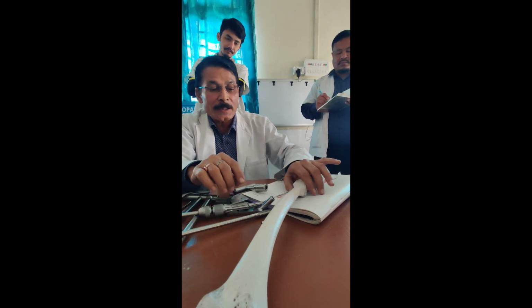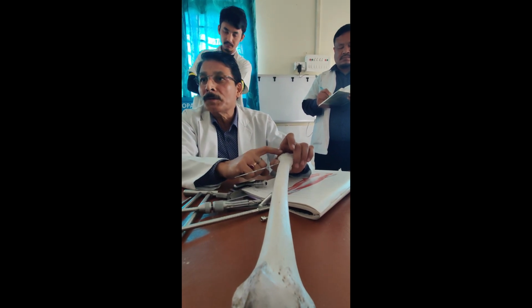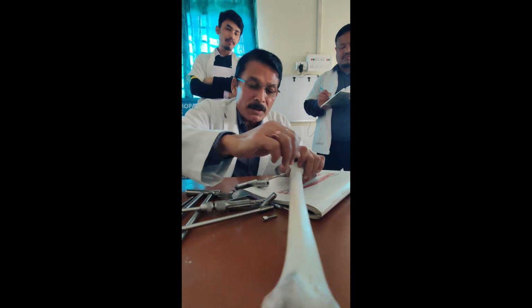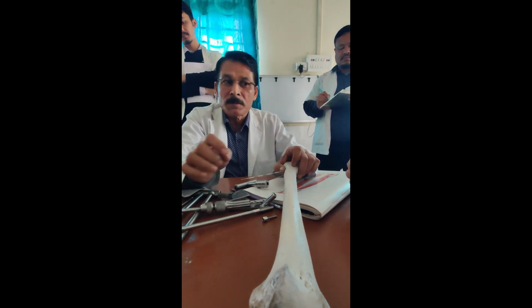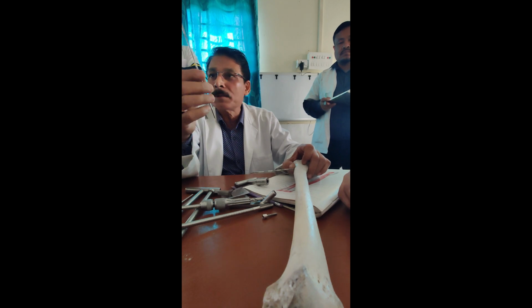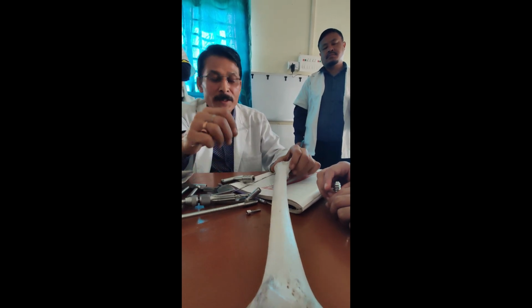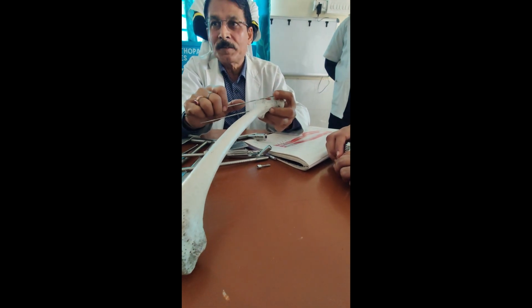Now, okay, everything is done. Now you are supposed to calculate the length of the screw. There are two techniques for calculation. One technique: you can subtract the part which is lying outside from the other guide wire. Another guide wire will be the same thing, so from this point you can make out. Or otherwise, you can put a guide wire inside.